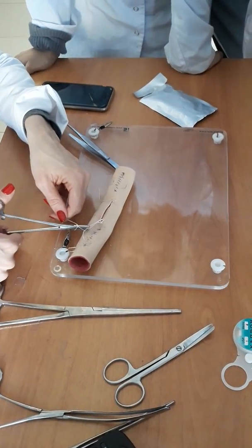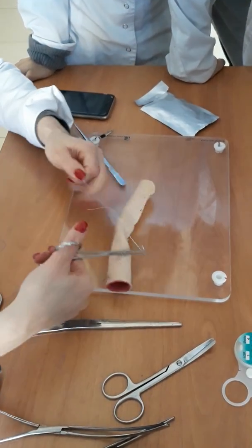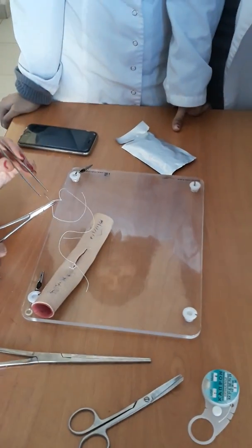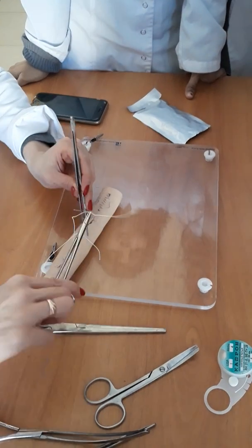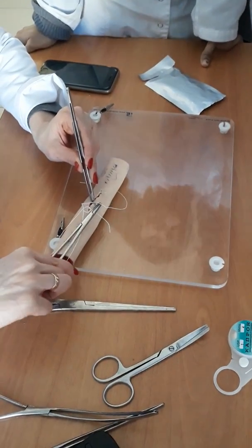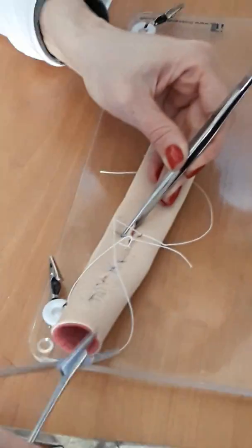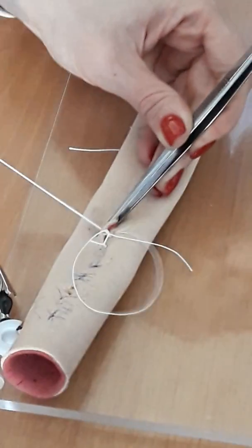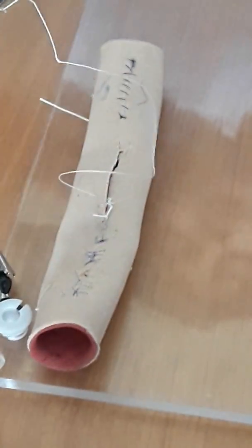After that on the opposite side. And after that here. And continue. Stitch 5 millimeters, between also 5 millimeters. And the assistant should help me. Be very careful.